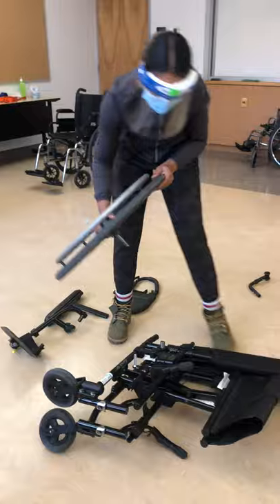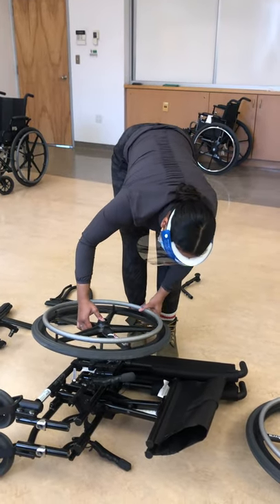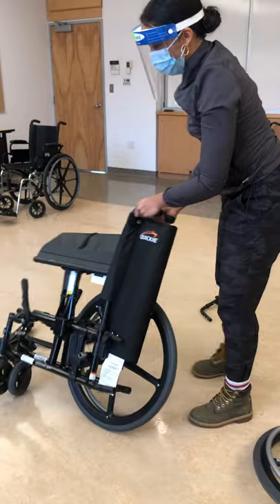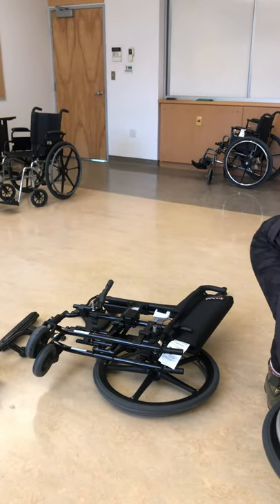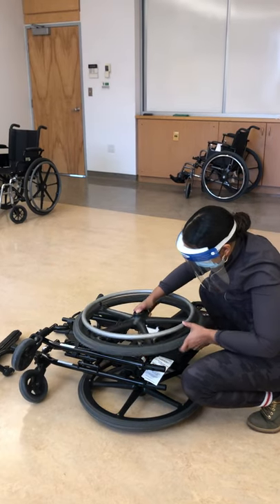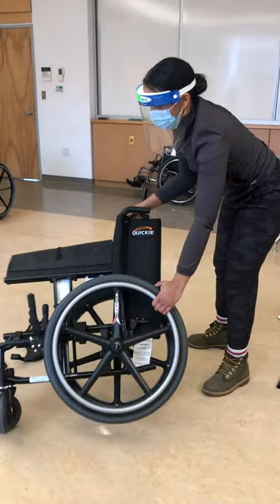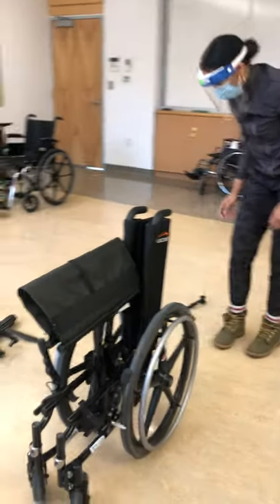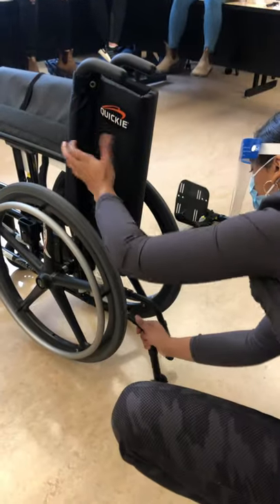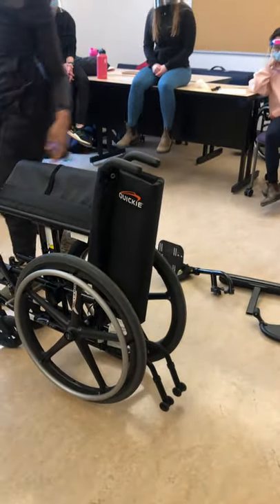We're going to put the wheels back in the slots and make sure they're pushed all the way in. Make sure those are clicked all the way in. Now we're going to open the wheelchair back up.